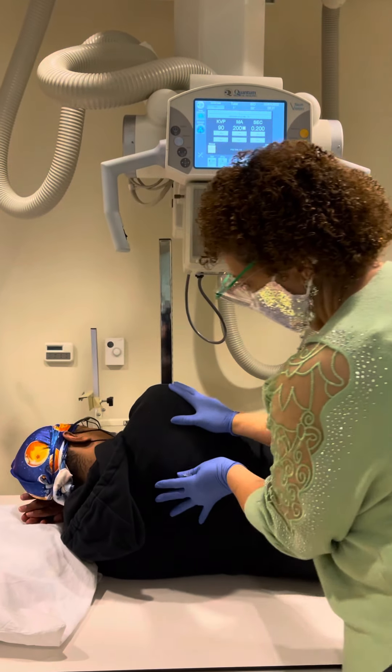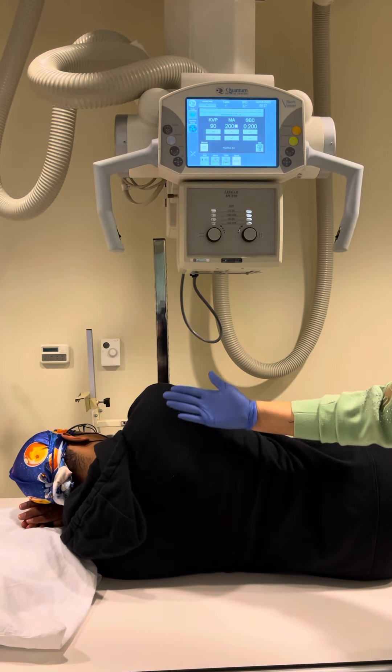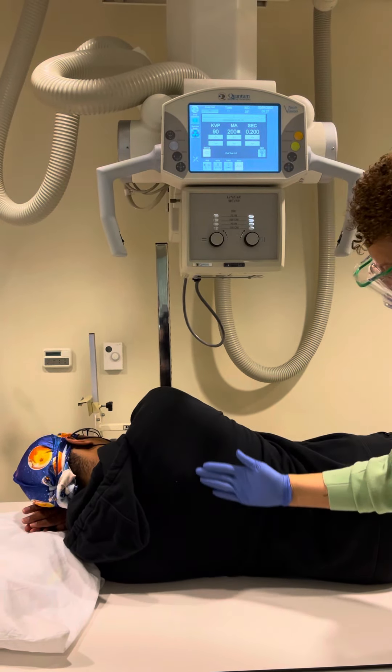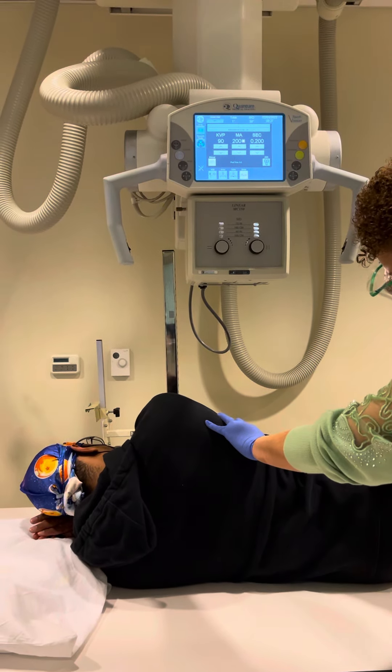I'm going to ensure that the patient is nice and straight. You can do this with a set of calipers, or you can do it just by bringing your hand down to make sure that everything's in line. I can feel that his hips are off but his shoulders are good.